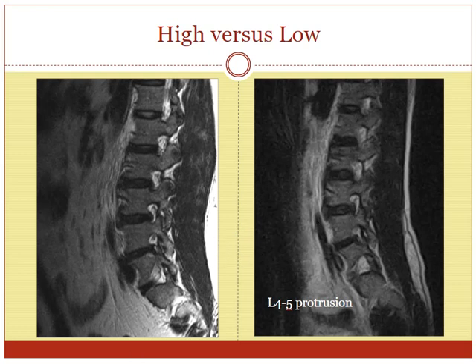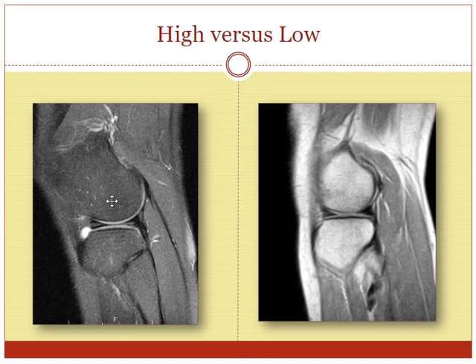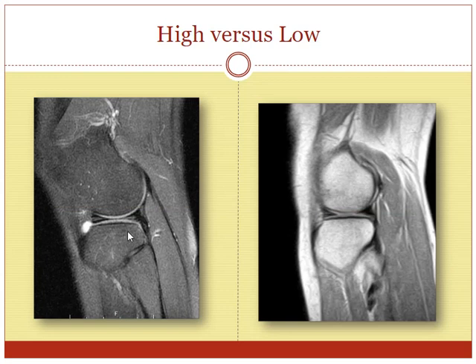This is a high field MRI on the left and a low field on the right — this is a knee and we're looking at the lateral meniscus. Here's the front of the lateral meniscus, which looks like a little wedge triangle, and here's the back. On the high field scanner we can see a little bit of horizontal signal within it — very subtle findings — and you can see some bony trabecula. The low field MRI scanner is just not quite as clean. In a good cooperative young patient these can look almost identical, but if the patient is not ideal the difference can be very significant.